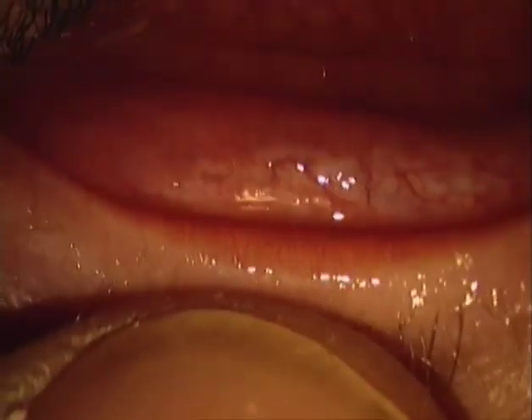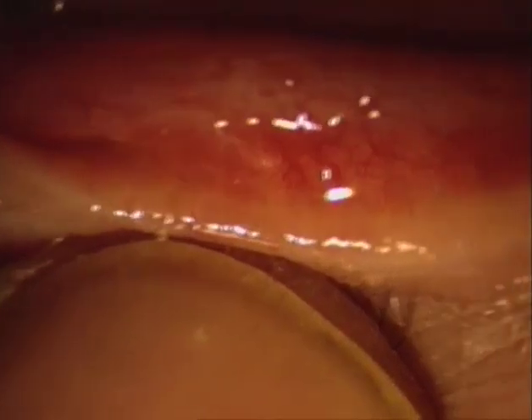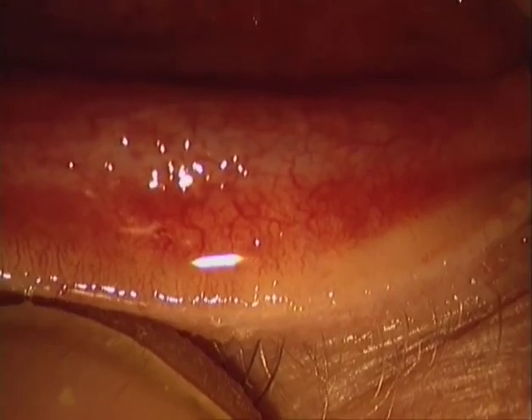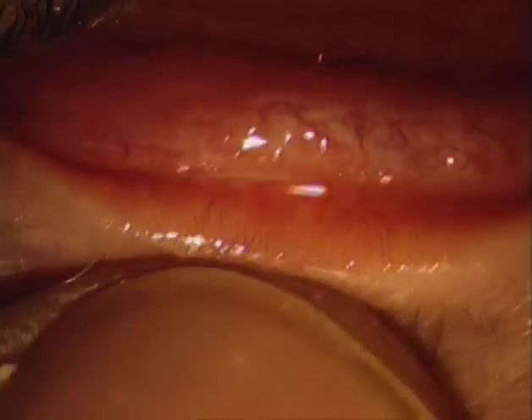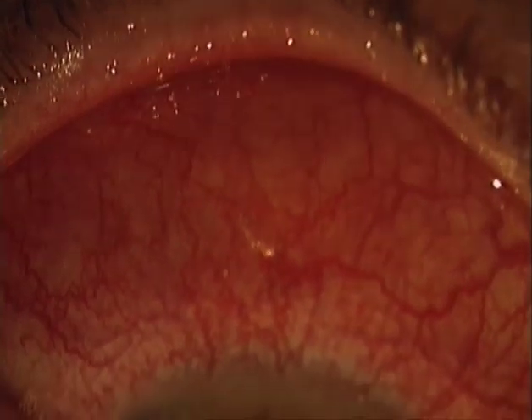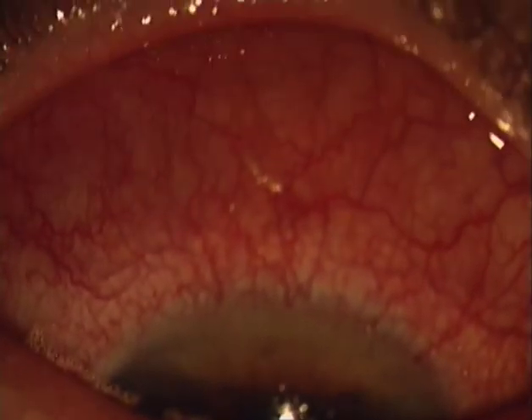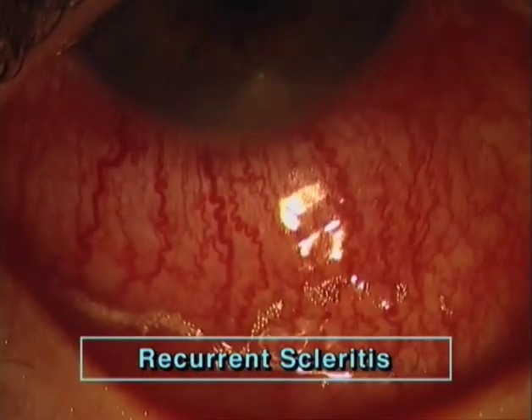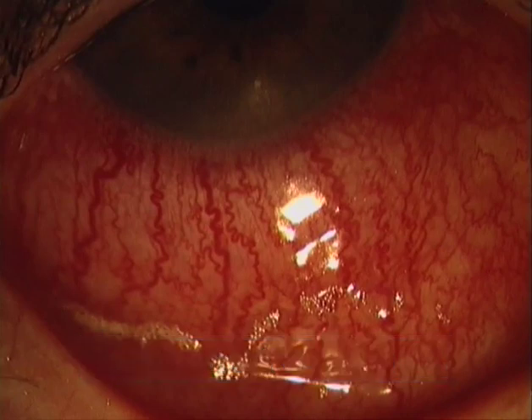When examining the conjunctiva of the lower lid, we find, beside a zone of artifactitious ischemia, just a slight irritation of the vessels in the orbital and tarsal conjunctiva. In the upper tarsus, there is only a mild reaction. The hyperemic capillaries do not hide the large tarsal vessels. The predominance of hyperemia on the globe indicates a bulbar disease, and the combination, with a reactive involvement of the conjunctiva, points towards an inflammation of the sclera.